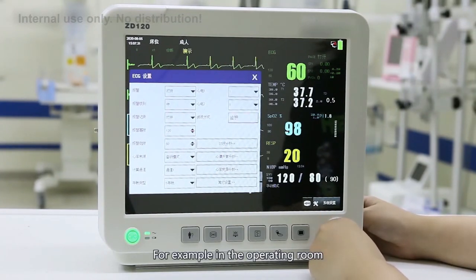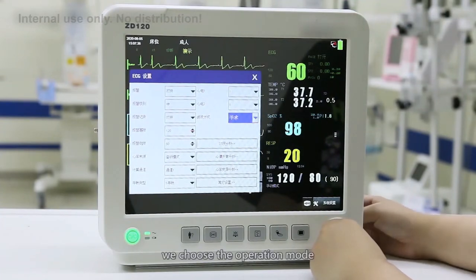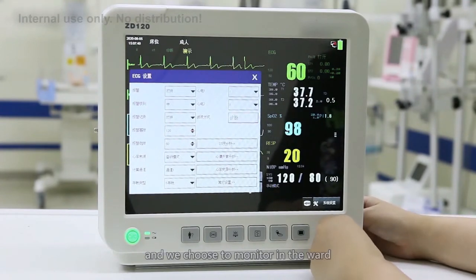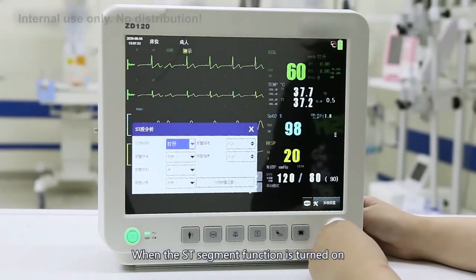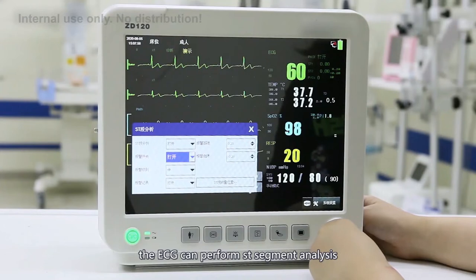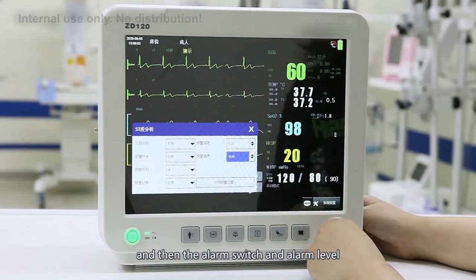For example, in the operating room where there is more high-frequency equipment, we choose the operation mode so that the ECG waveform is not easily interfered with, and we choose monitor mode in general ward settings. Below is the ST segment analysis. When the ST segment function is turned on, colleagues monitoring the ECG can perform ST segment analysis. On the right are the upper and lower limits of the ST segment alarm, the alarm switch, and alarm level.